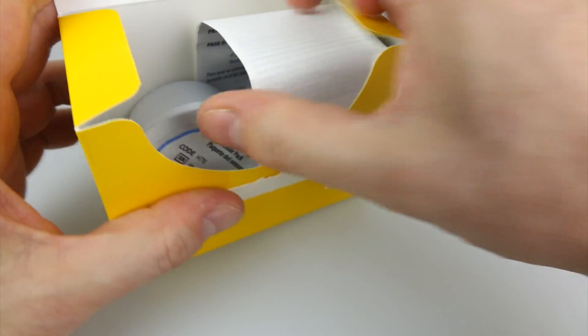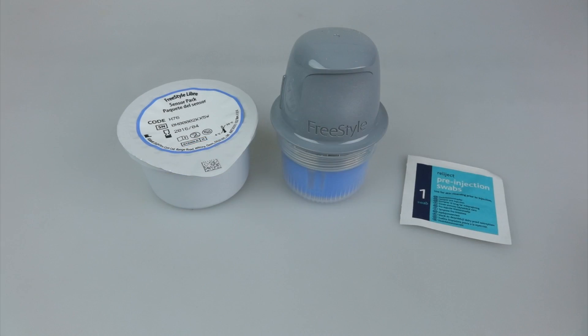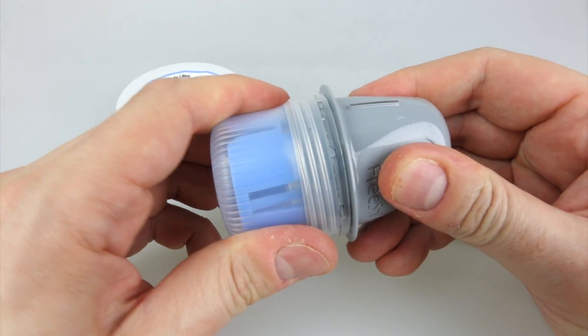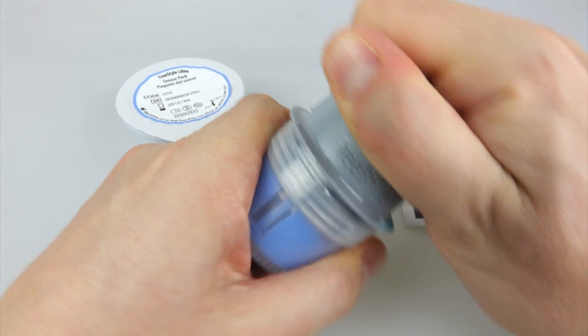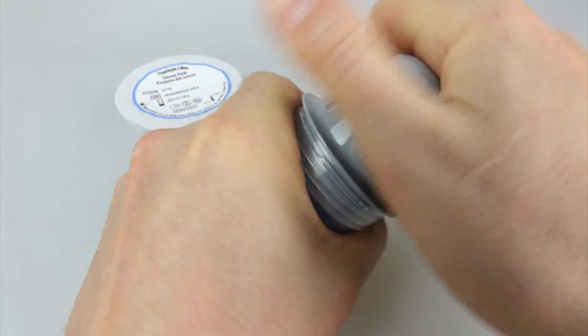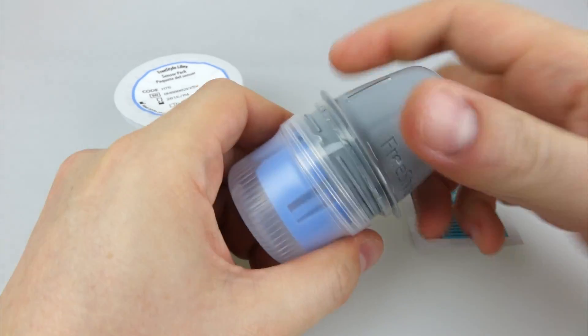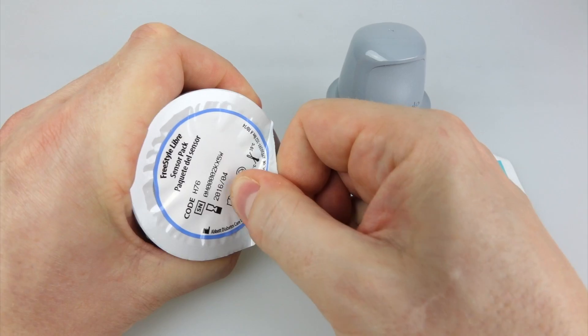At that price you really want to make sure you put them on properly because it's a one-time deal — if you get it wrong that's £50 down the drain, so I'm going to show you how to do it now. Inside the box you get the applicator, which is the thing I'm opening up now. It's quite tight to open because there's an adhesive pad in the top, so it's got to remain airtight — that's the adhesive pad on the right there.